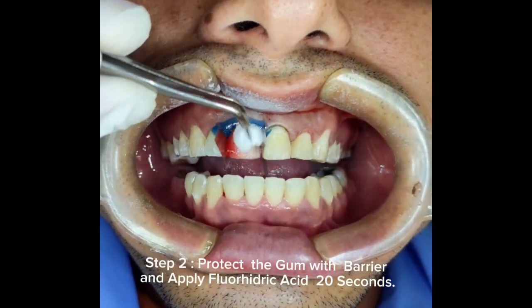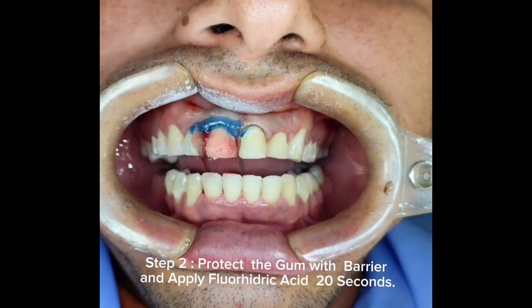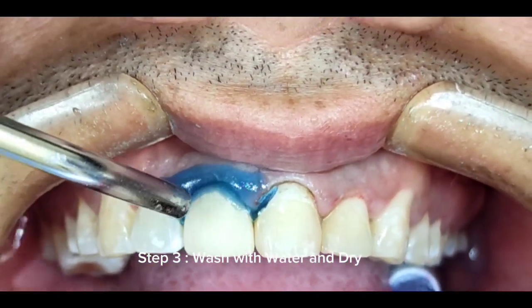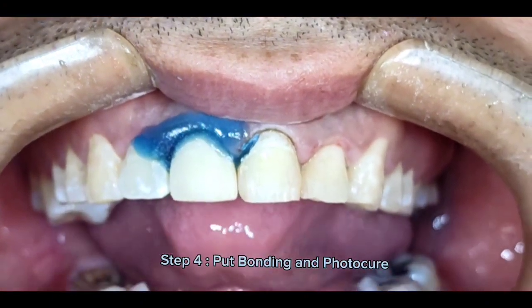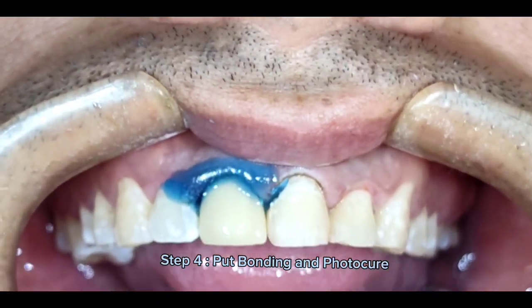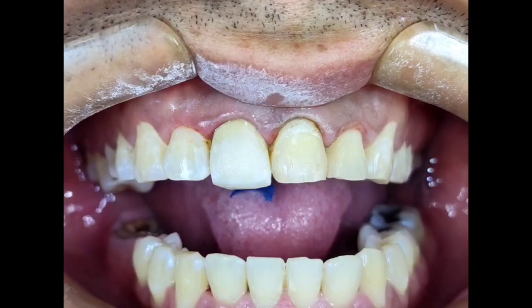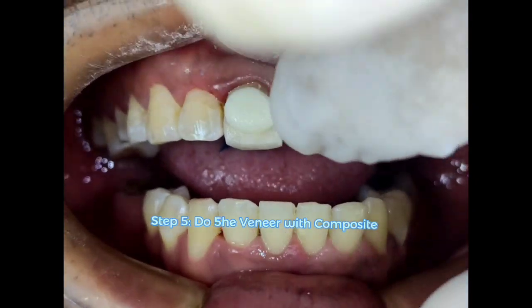After the time, first remove the acid with a cotton roll, removing as much as you can, and after this rinse very well with water and dry very well. Apply gentle water over the porcelain crown to remove the excess acid. Soak up the saliva and the water very well, and after this dry and apply the bonding. A normal bonding; I like to use Single Bond 3M, but there are many good ones. Remember to light cure the bonding. And now the porcelain tooth is ready for the composite.